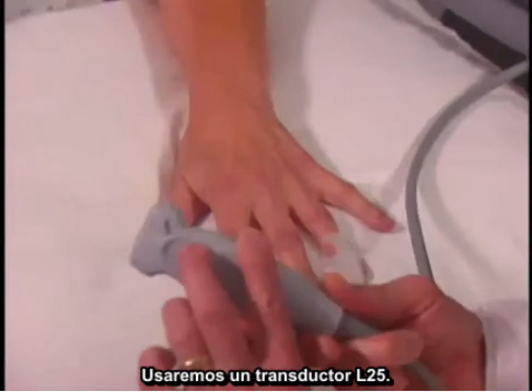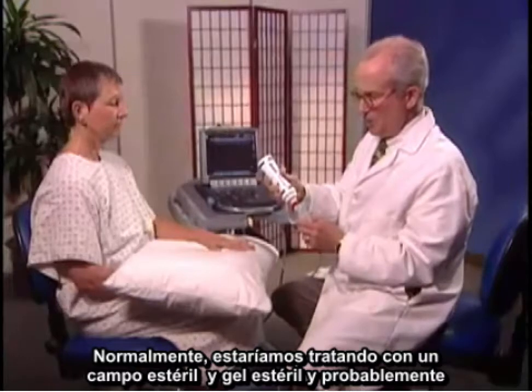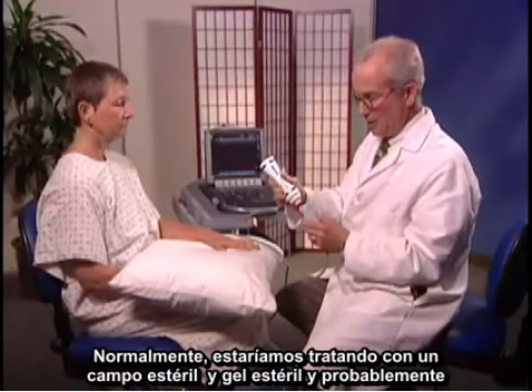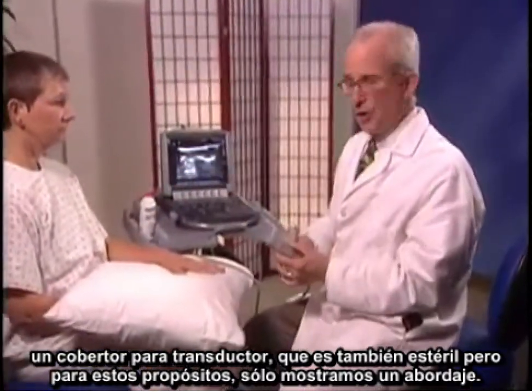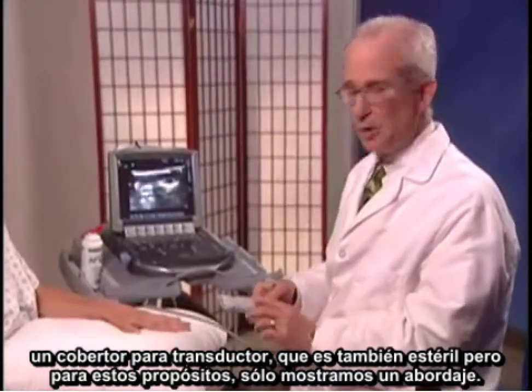I'm going to use the L25 transducer. Normally we would be dealing with a sterile field and sterile gel, and most likely a transducer cover which is also sterile, but for the purposes of this, we're just showing you an approach.